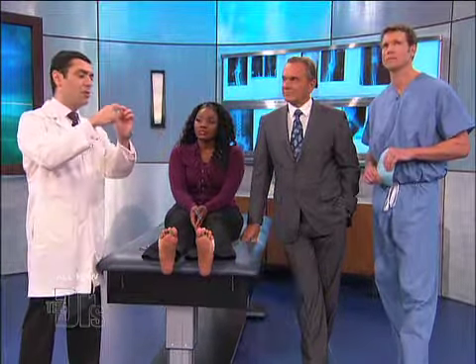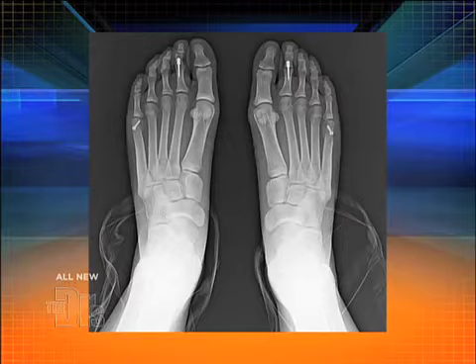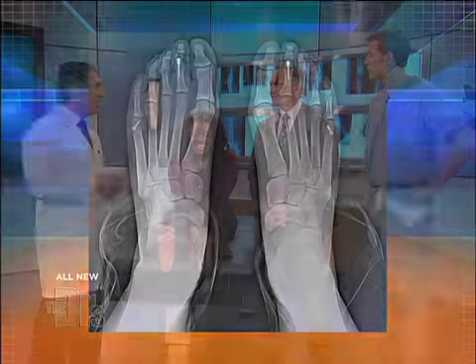But then more importantly, the second toe, because it was longer, was kinking up, pushing back. So what we're compelled to do is straighten it out, but also shorten it. That's what this device helps us do. And you see on the post-op x-ray that those screws are actually holding the toe indefinitely until it fuses. And so she'll be back on her feet very shortly. She can walk normally.